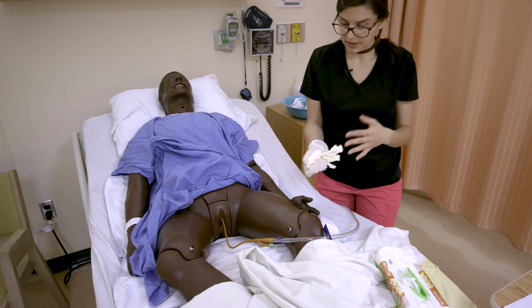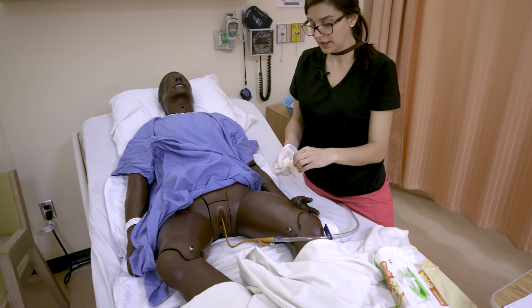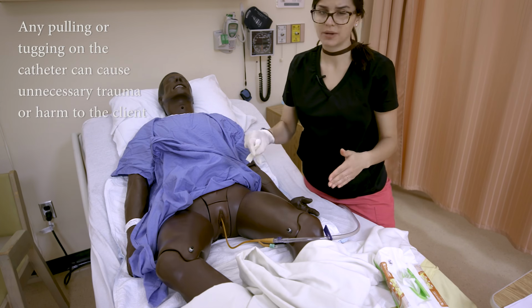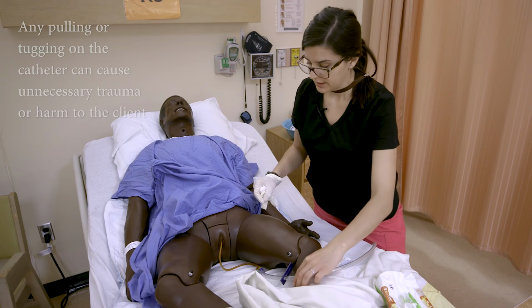So those are the main principles. You do want to be careful when you're doing it that you're not advancing the catheter in any way again, and you're not tugging too hard, pulling out. So just keeping those in mind, and that's why we're stabilizing whenever we're doing anything that's sort of on the catheter itself. So that's it.